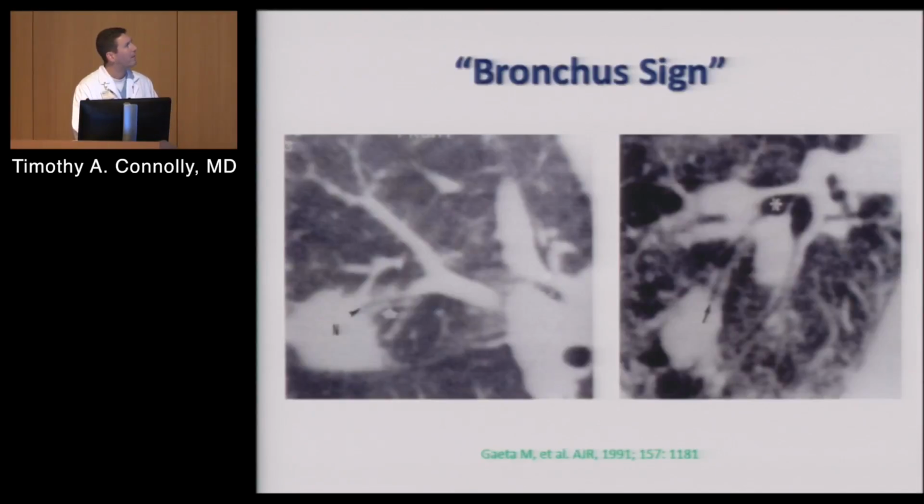This is a real close-up, but the point that it's trying to make is if you look, this is actually airway right to here into the nodule. So this is going to be a tiny little peripheral nodule. And rather than trying to find a needle in a haystack, we can do this thing called superDimension bronchoscopy.